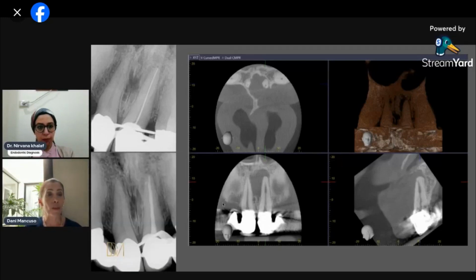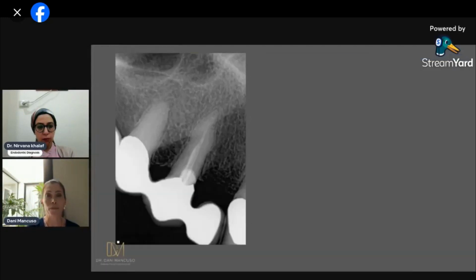And in root canal treatment, when the radiolucency is more lateral, you can expect a lateral canal. What about this case? This case is a bridge, isn't it? So it's difficult when you have pain, because when you do percussion it vibrates the whole bridge, so your patient cannot tell exactly where the pain is coming from, and neither can you.